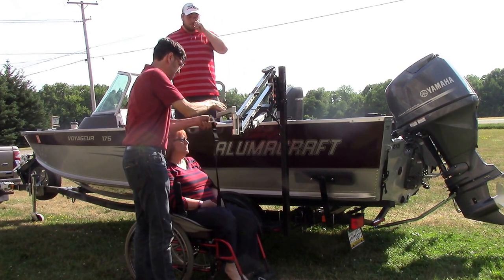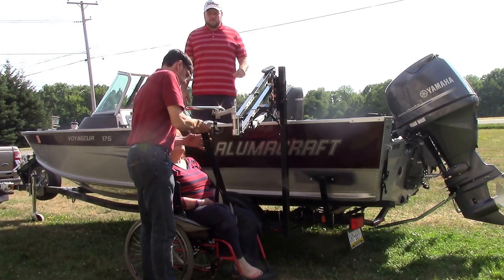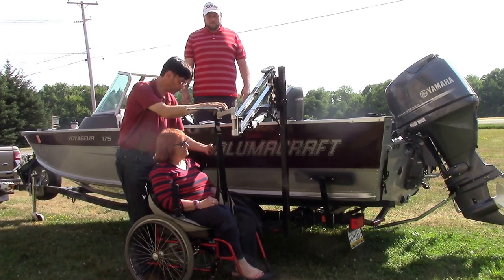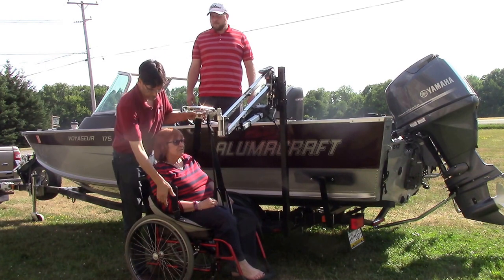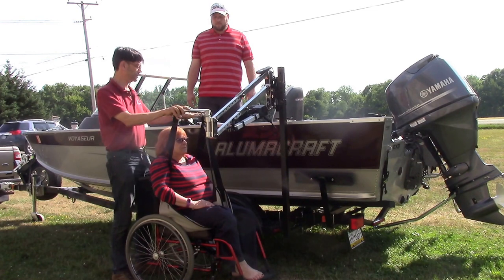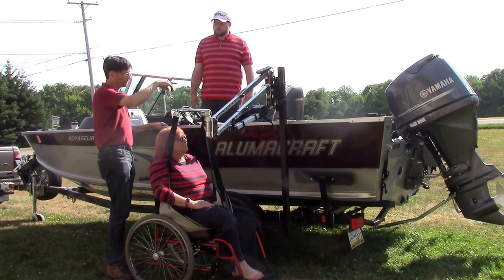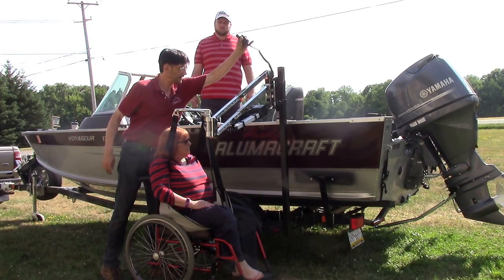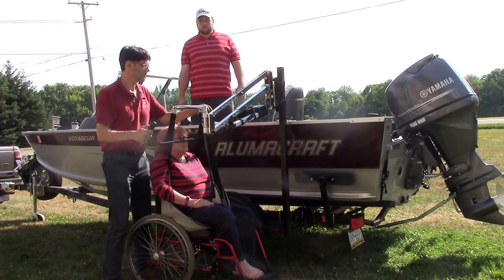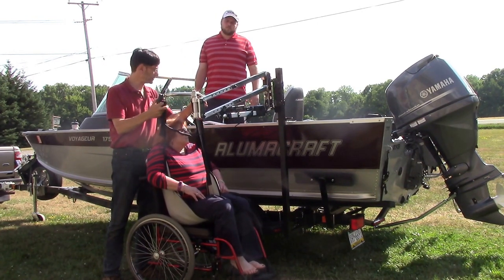Our first step in connecting is to hook the leg straps up. Next we'll hook the arm straps up and we're going to go into the boat into the front seat. Of course you can hook this up in this area right here. Some people want it over by the transom, but in many cases we're going to want to have it right where you see it, right here. The unit is cordless so we don't have to hook up any electricity. We're going to bring the person up.